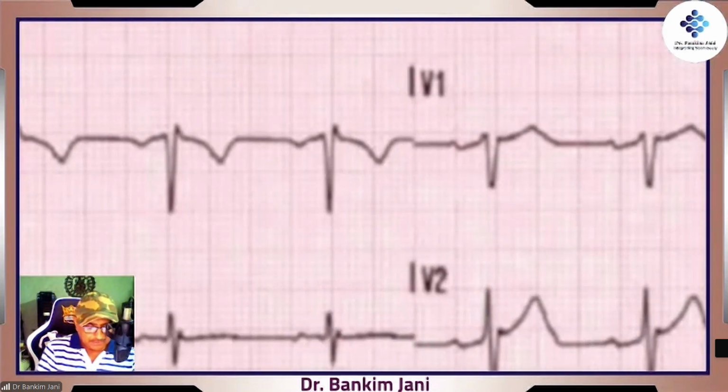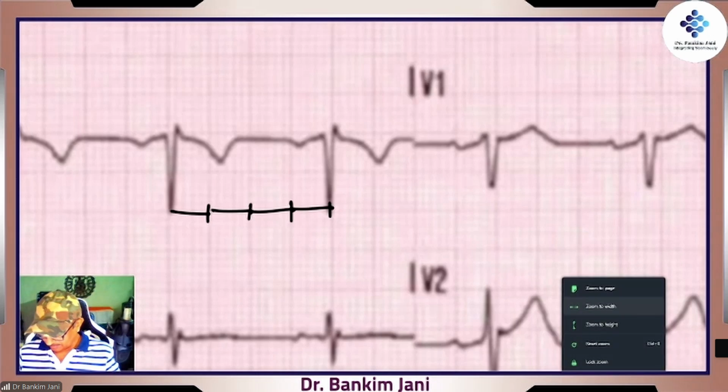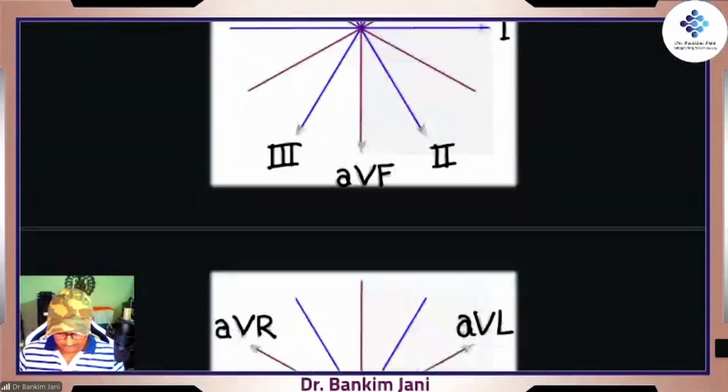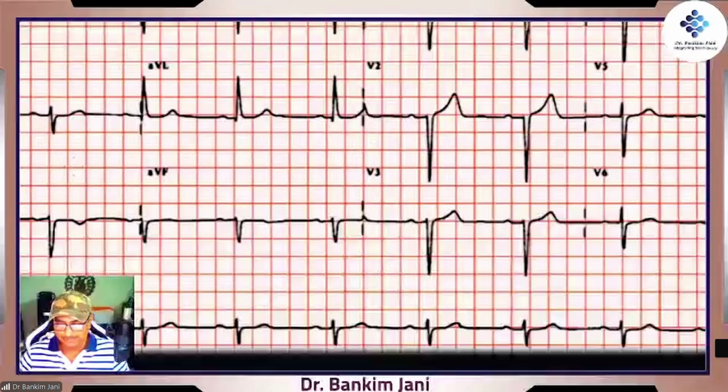It is easy, no? This is 1, 2, 3, 4. 4 big squares. 75. Anyone who has written 100, just see that thing. It cannot be 100. If you're calculating small squares and you come to 77, Shavani, you're right, no problem. Very good. Seen so clearly.